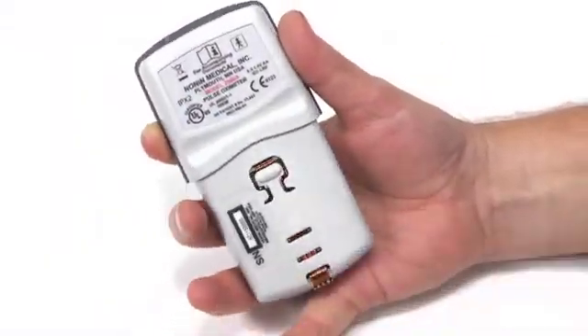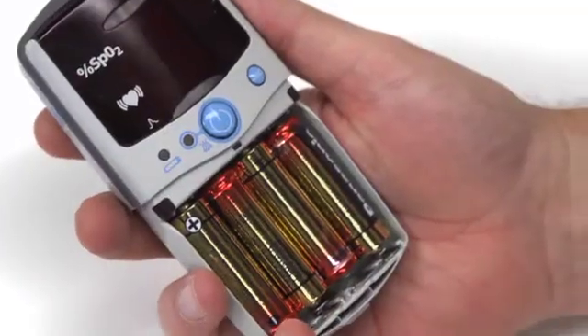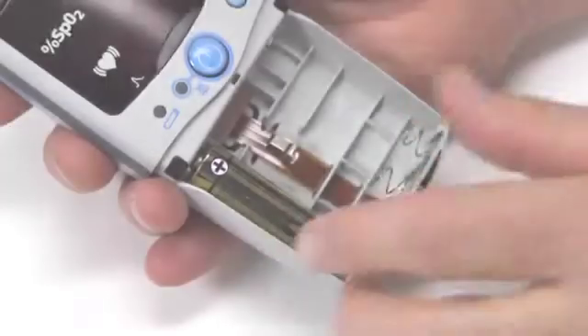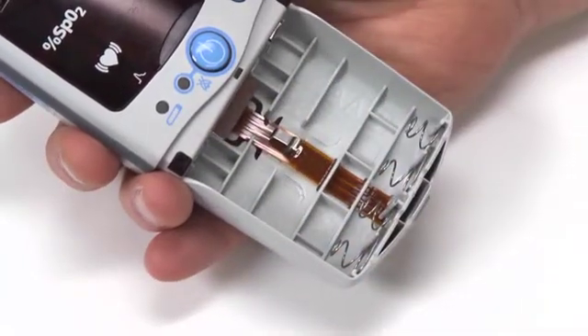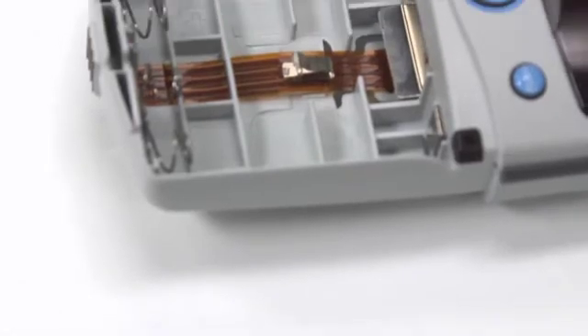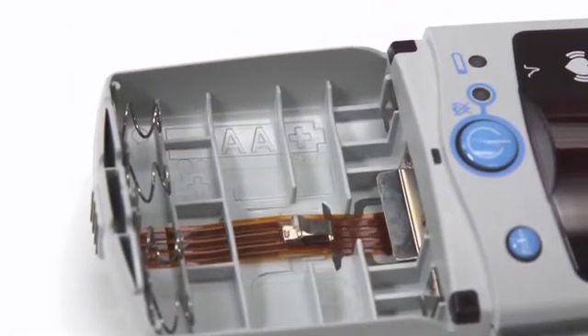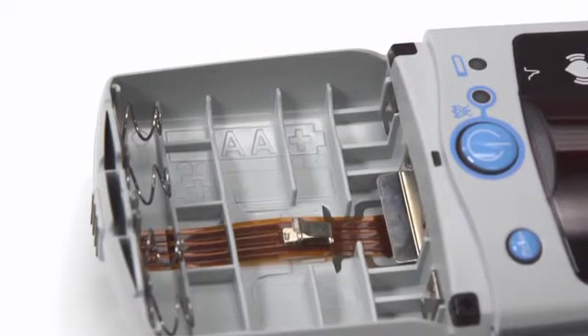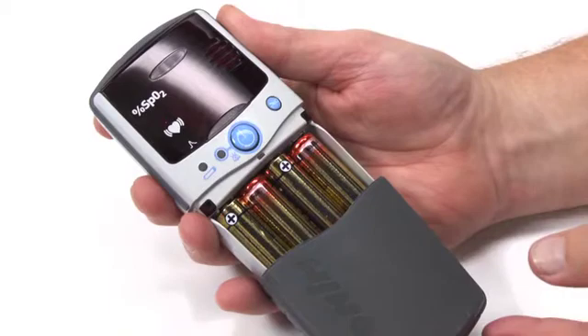To replace the batteries, remove the battery cover by pressing the cover latch and sliding the cover off. Remove the used batteries and insert fresh, fully charged AA batteries. Proper battery position is critical for oximeter operation. Note the battery polarity position marked in the case to properly install the batteries. Replace the battery cover so it clicks into place.